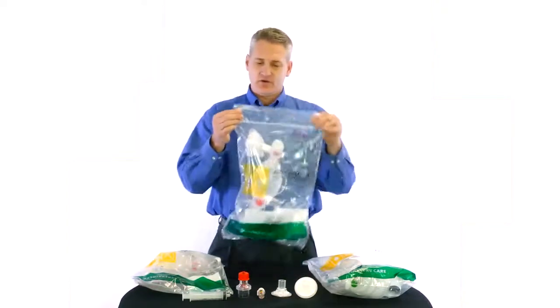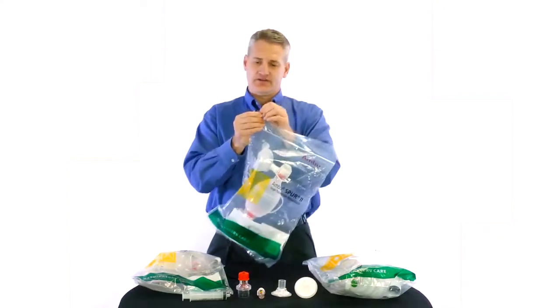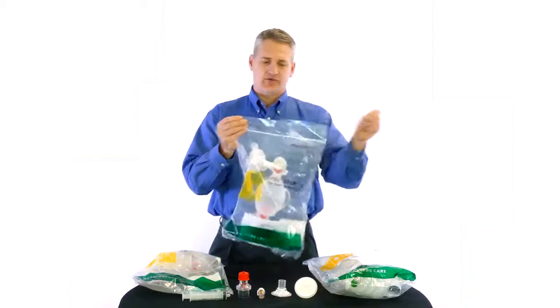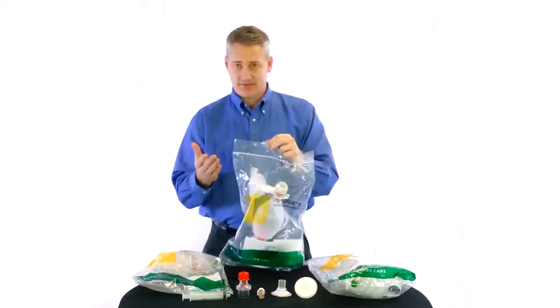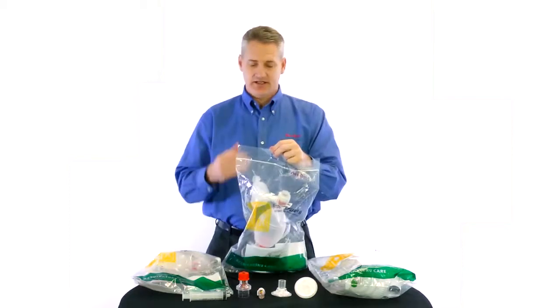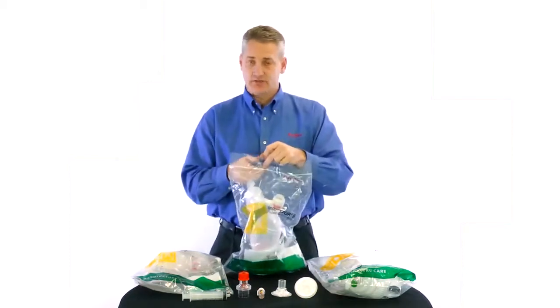One thing we incorporate in our external packaging is our perforation — a quick-release perforation that comes right off. If you see this perforation is missing from the bag, that means it has been tampered with. There could be something missing, it may not have all its parts, or it could have been used on other patients.